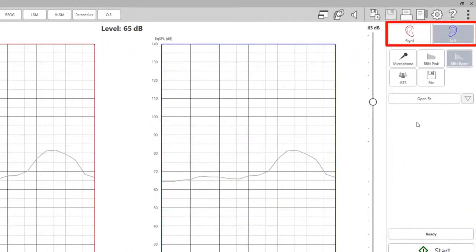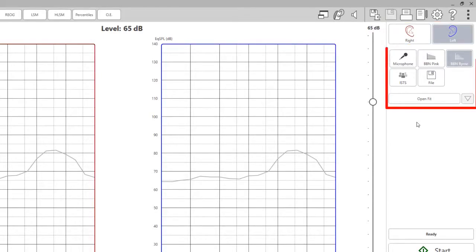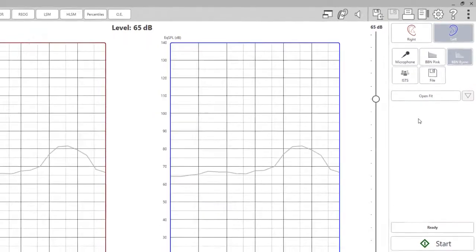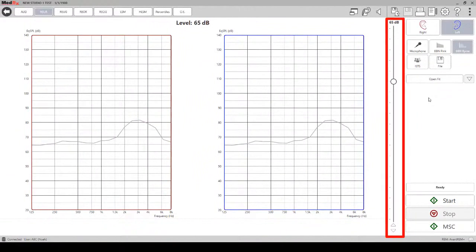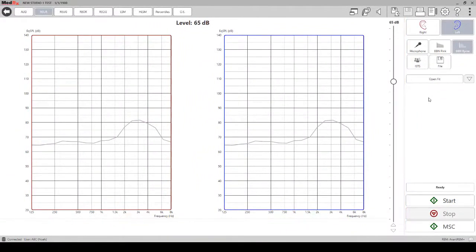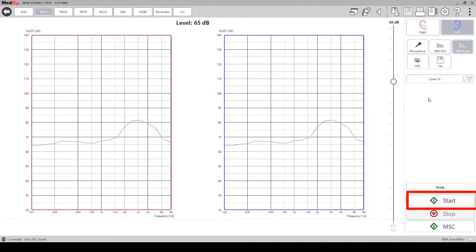On the right hand side you can change the ear that you are taking the measurement of, the stimulus, and the intensity level of the signal. Click start to begin the measurement. It is important to let this run in its entirety.